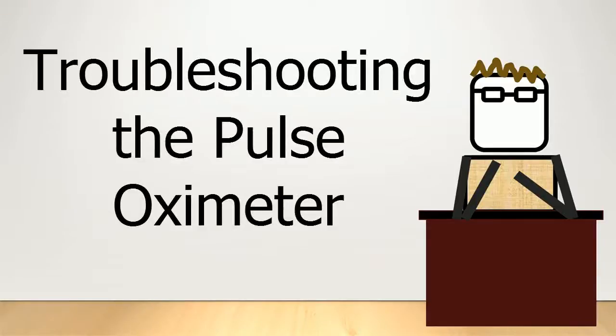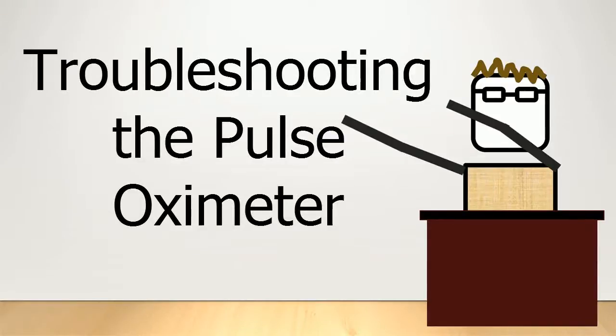Welcome to a basic introduction to mechanical ventilation. This is chapter 3.2, Troubleshooting the Oximeter.